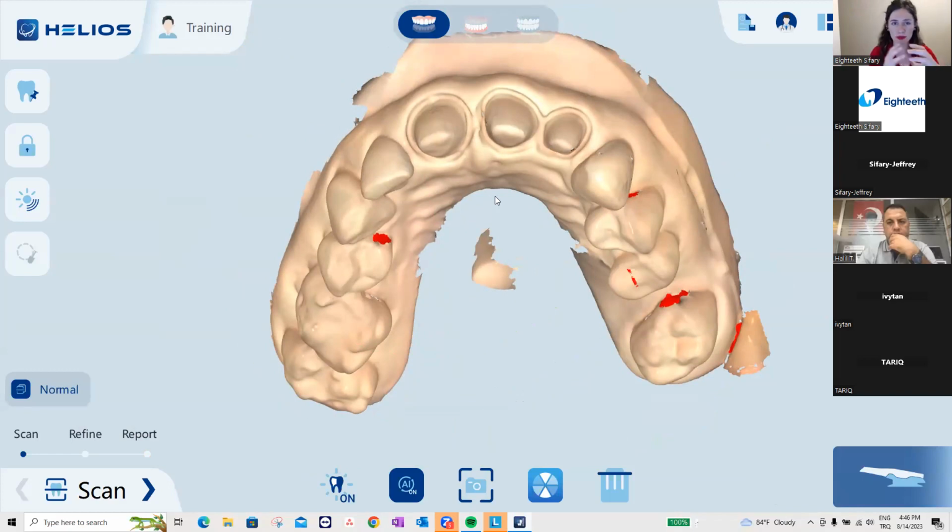It could all get mixed up. What we recommend is that we don't want saliva and blood. This is very important. A doctor can use air pressure to get rid of them. And if there are multiple preparations, continuing to scan could cause some problems.